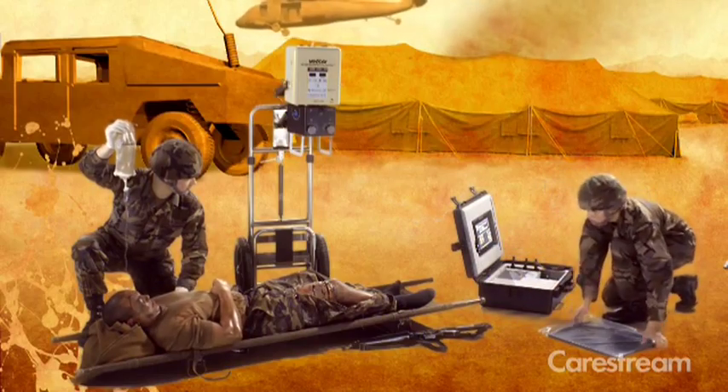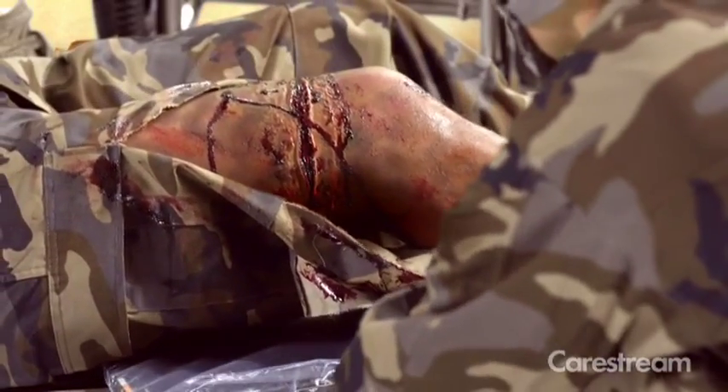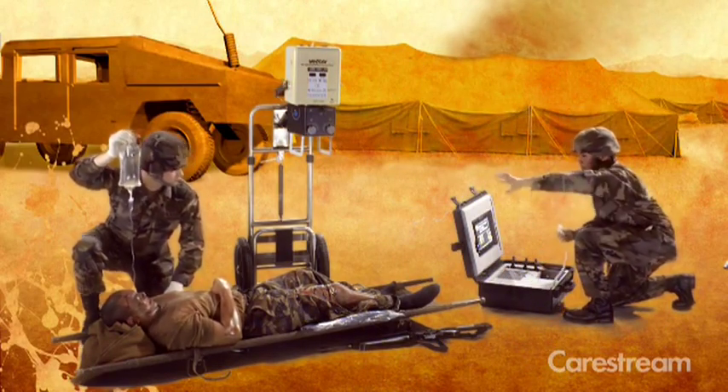All securely packed in a sturdy, waterproof, compact carrying case. The wireless DRX detector eliminates cords and tethers for easy patient positioning and maximum infection control.